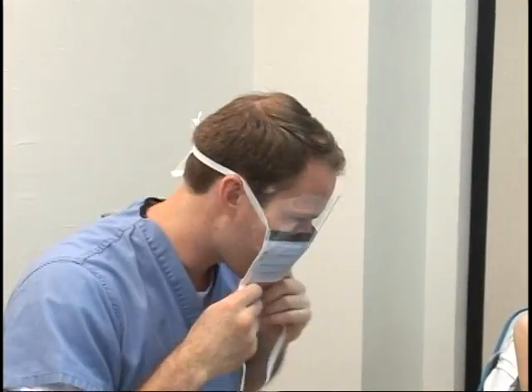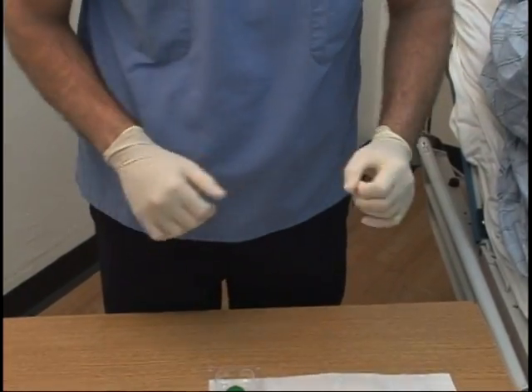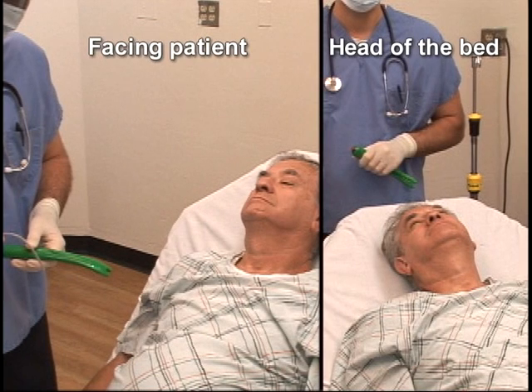Put on your gloves and mask with facial shield for your protection. Depending on your preference, you can either face the patient or stand at the head of the bed.